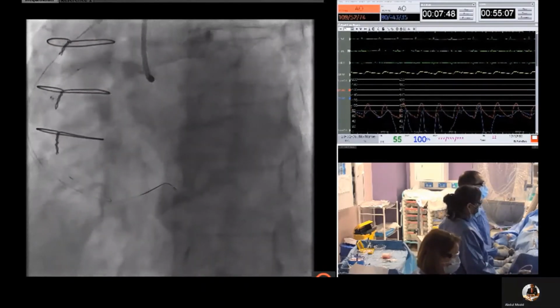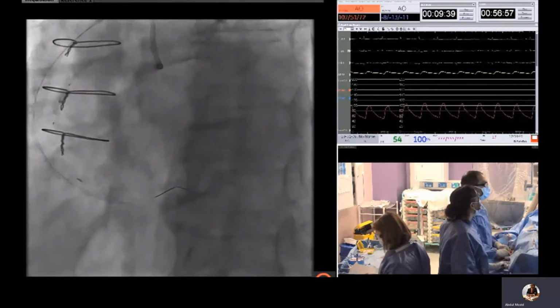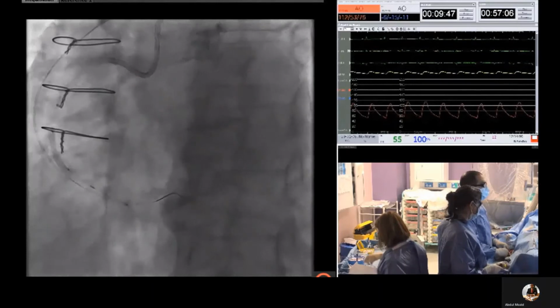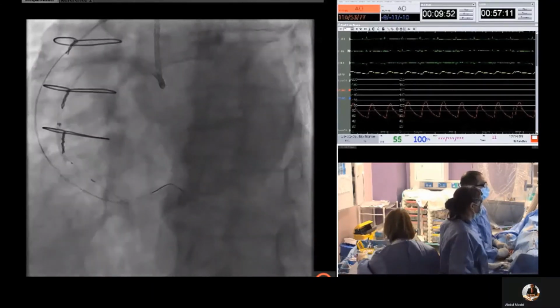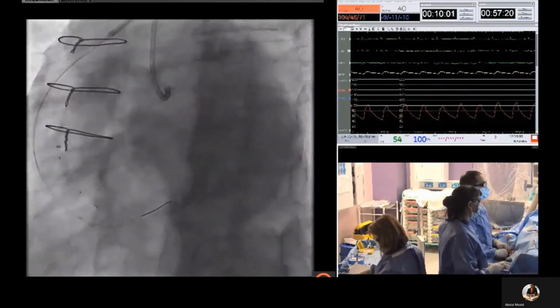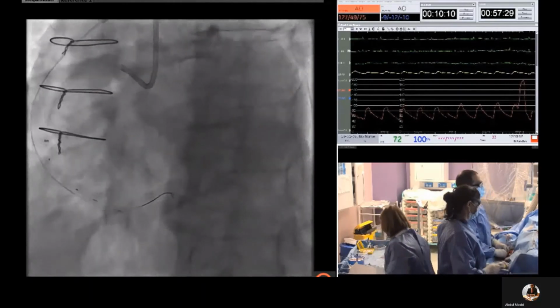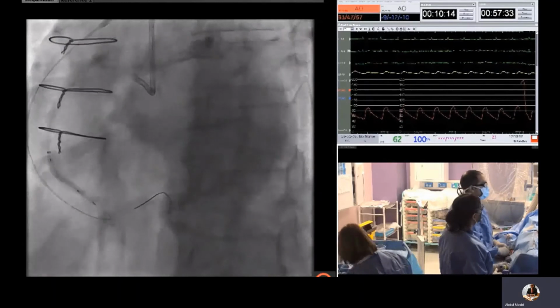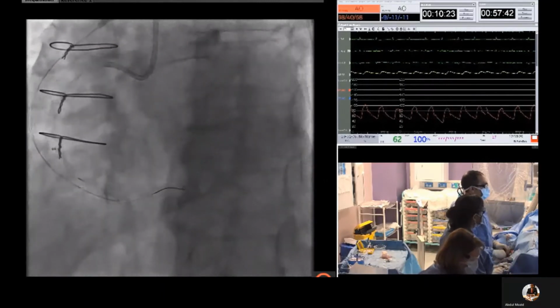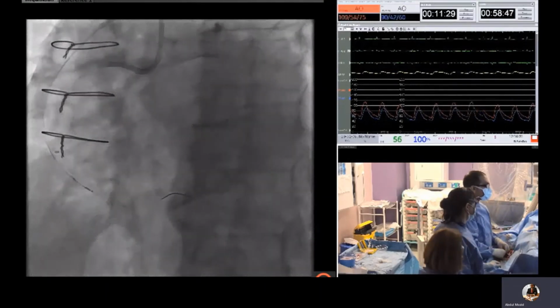And then the Guidezilla extension catheter is delivered over the balloon. Some more preparation with a 3 millimeter NC balloon to allow deeper engagement of the guide extension catheter. That was demonstrated here. So this is the inchworming technique, demonstrated nicely, of how to deliver a guide extension catheter. This is very helpful in heavily calcified vessels. So we've now opened the mid-right coronary occlusion.